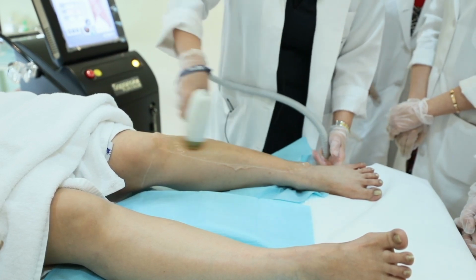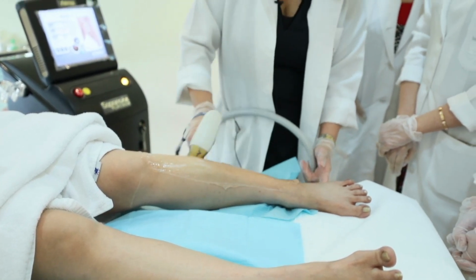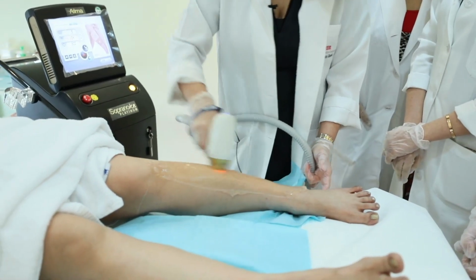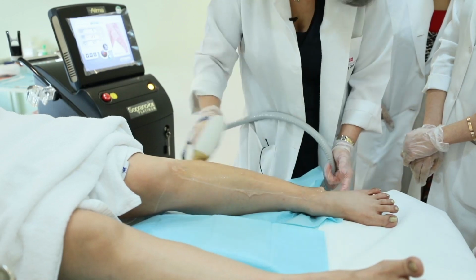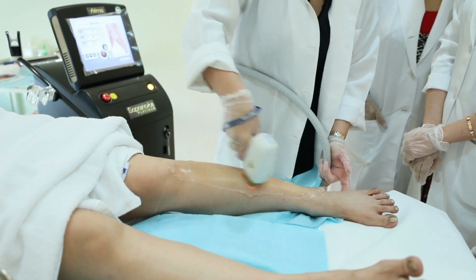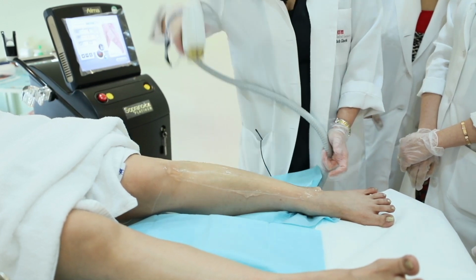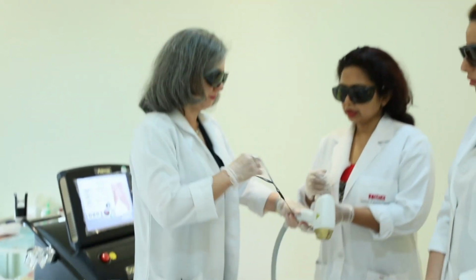How is your sensation? Are you okay? Yes. So, do you see what I'm doing? I'm covering everywhere like a brush, not repeating any line so much, and continuing the motion. Once I have a curve in the body, it's my job to turn my hand to be able to be always perpendicular to wherever I'm doing the treatment. I leave my finger, continue motion, and then I detach my contact cooling laser. So, are you ready? Yeah, sure.